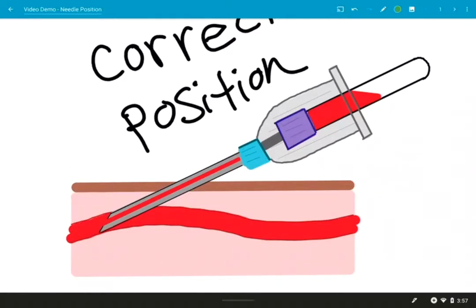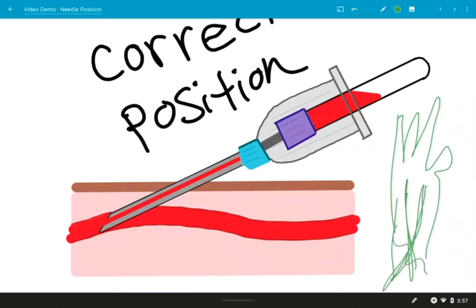And lastly, you want to make sure that your needle is 30 degrees to the skin surface. So this angle right there is going to be 30 degrees. And also make sure you notice what direction that your vein is going. Not all veins are going to run up and down the arm. Some are going to be diagonal or wandering.